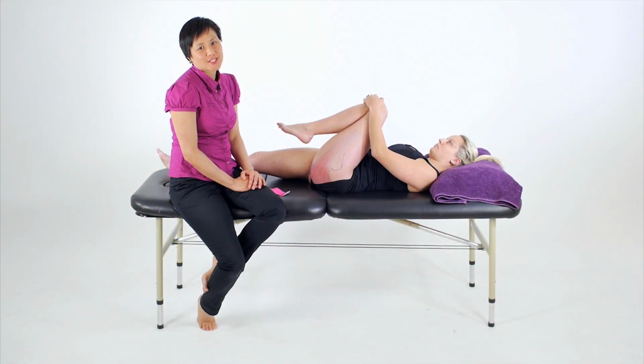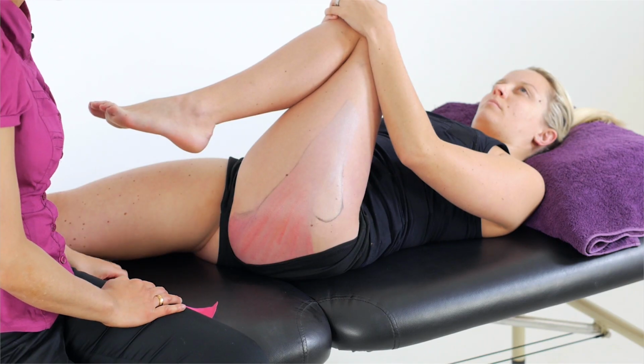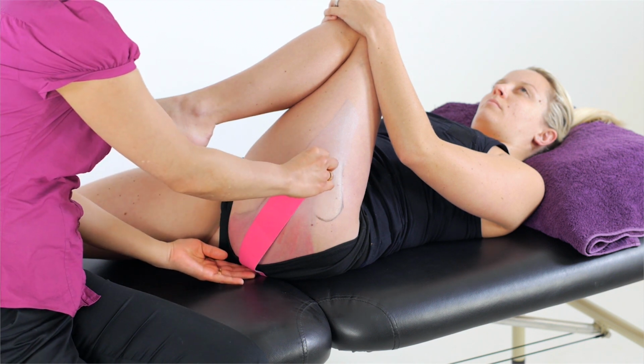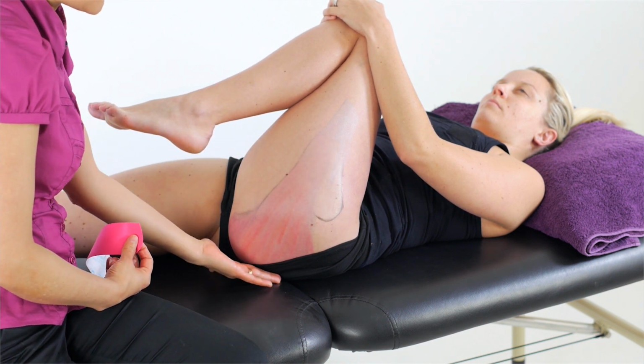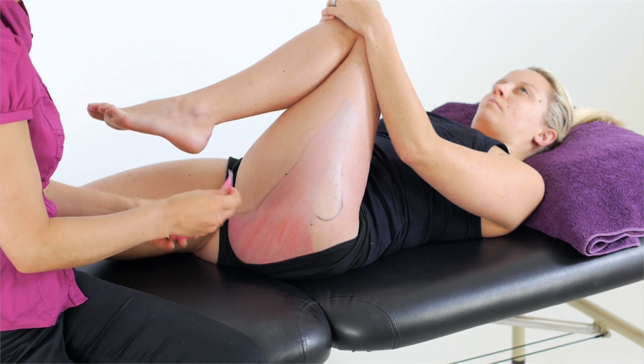For a strength application to the gluteus maximus, we'll first place our client in the lengthened position, so supine with the knees towards the chest and across to the midline, or in side lying. From here we measure a length of tape to cover the muscle from the origin into the insertion, so either from the sacrum or the ilium, whichever fibres you felt were most problematic.